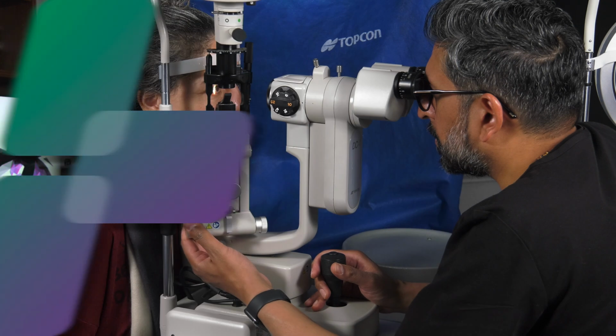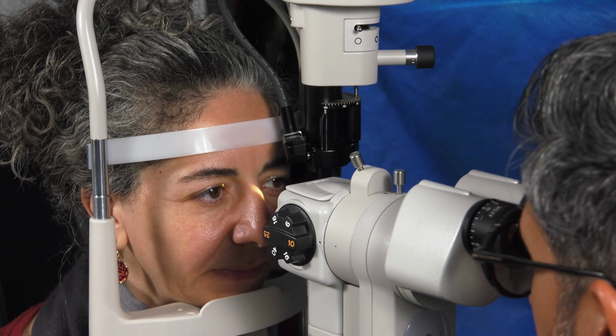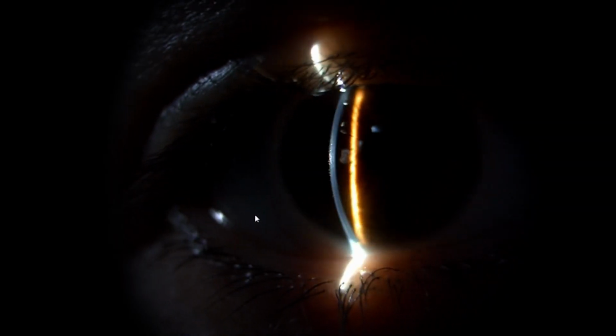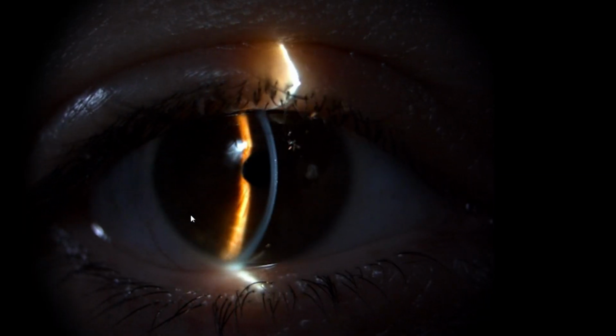In this video, I'm going to be showing you how to use the optic section with your slit lamp to look at the cornea. The slit lamp is so called because it can be set up to create a narrow slit beam to provide detailed cross-sectional images of the semi-transparent ocular structures. LED illumination is ideal because it maximizes the scattering of light by these structures, and hence increases visualization of the layers and potential abnormalities. An optic section of the cornea is an effective way to examine corneal layers and determine the depth of any corneal abnormalities.